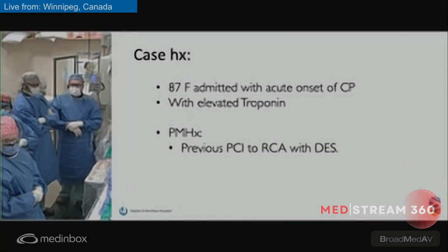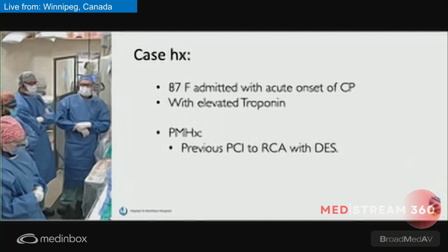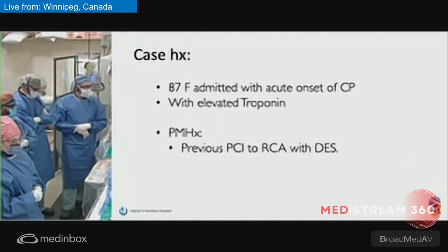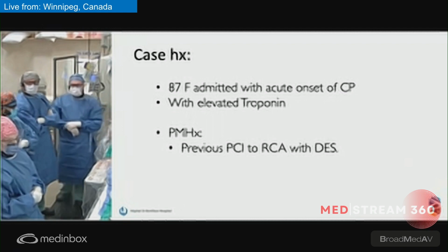Welcome from Winnipeg. We have a great calcified LAD case for you today. We'll do some calcium modification. Our goal is to be able to image the vessel and also be able to do some rotablation and potentially IVL if needed. Let's go to the next slide.